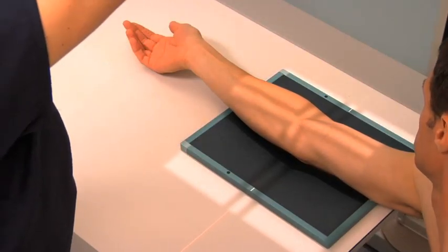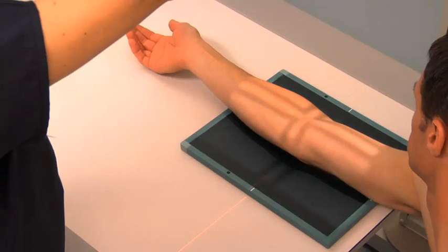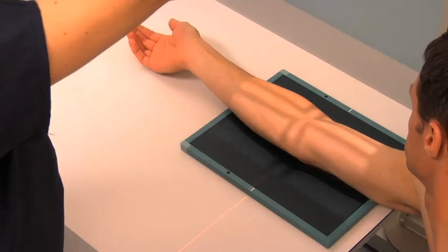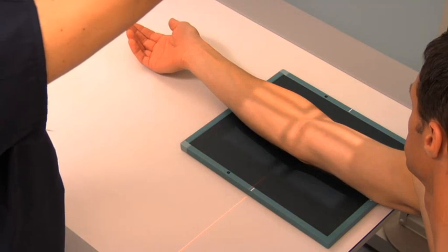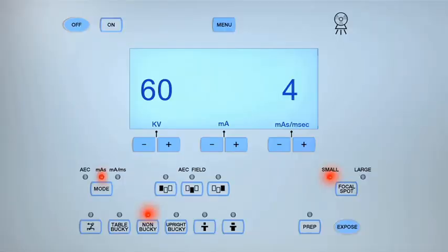Center the central ray to the midpoint of the elbow joint. Collimate the light field to include the sides of the patient's elbow joint, distal humerus, and the proximal radius and ulna. Position the lead marker appropriately. Check the exposure technique and expose the cassette.